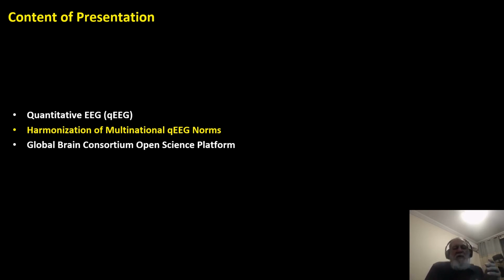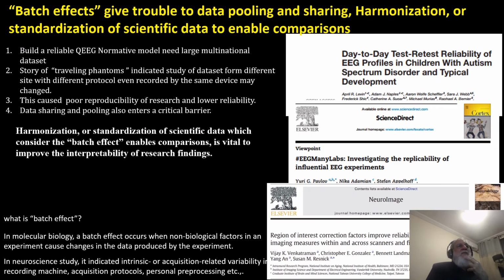So we tried a test project that tried to address these issues. It's very simple. The idea is based on the experience that has gained a lot of interest to compare data, let's say, for the MRI. The people in ENIGMA have been in this, and the problem is how to have multinational studies, of which you see several there, and how to deal with what they call the batch effect. This batch effect is something that came up in bioinformatics. There's a method called ComBat that's being used a lot in neuroimaging, either in the simplest form or a form that works with functional data. And that is something where we have the same problem.